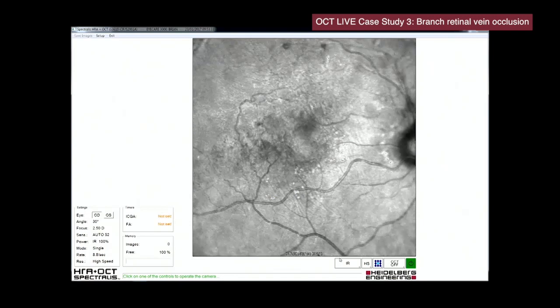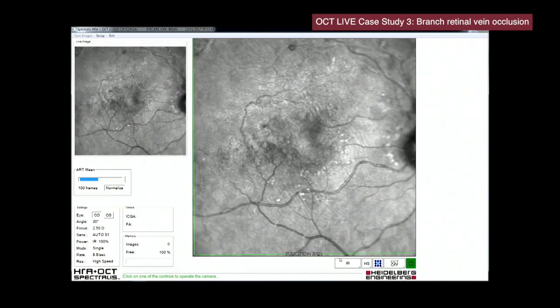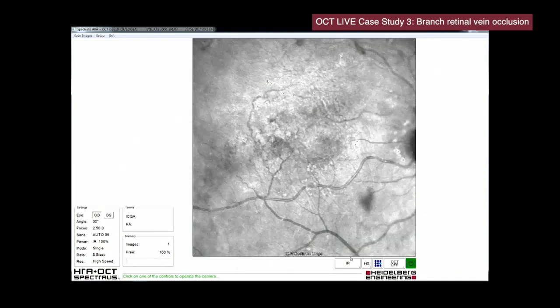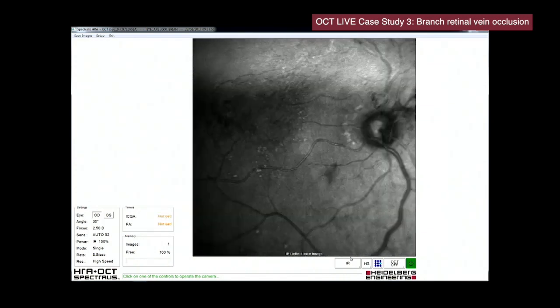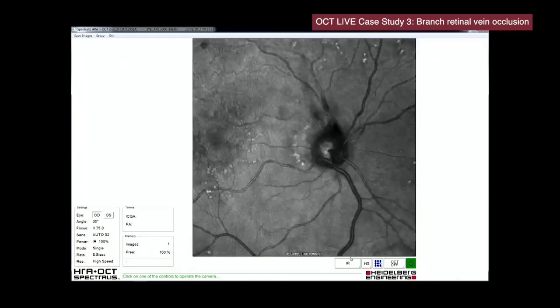So infrared light, whilst it's long wavelength, it's invisible to the patient and it penetrates the ocular structures deeply. It's very easily absorbed, and the thing it's easily absorbed by is fluid. So either fluid within the retina, underneath the retina, or underneath the RPE. So if we want to identify where we have breakdown in blood-retinal barrier, it's very, very obvious from this image.